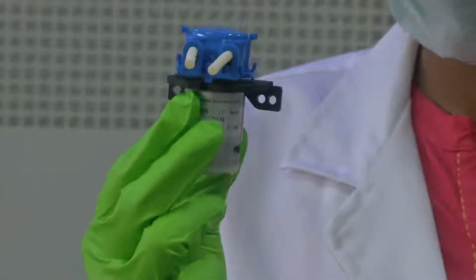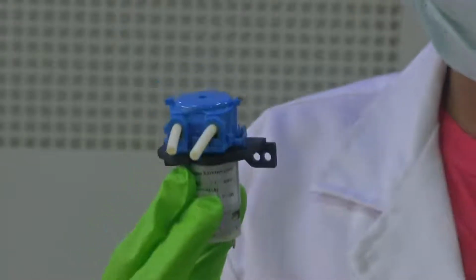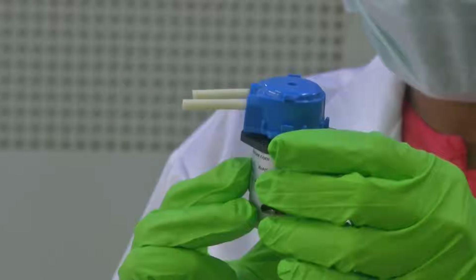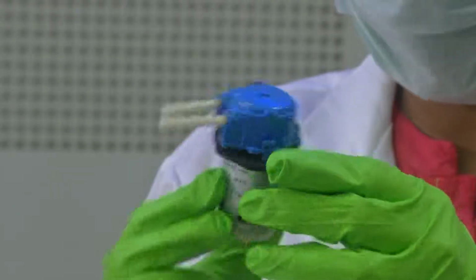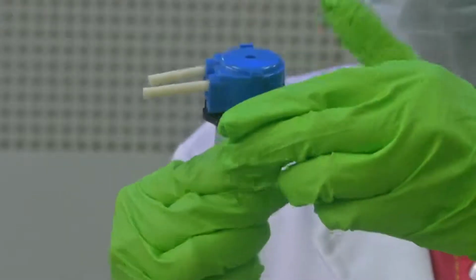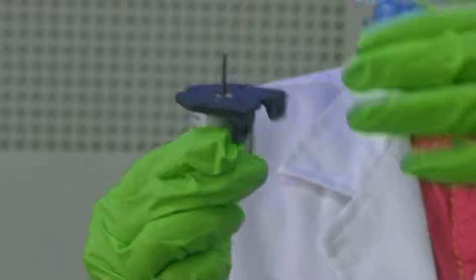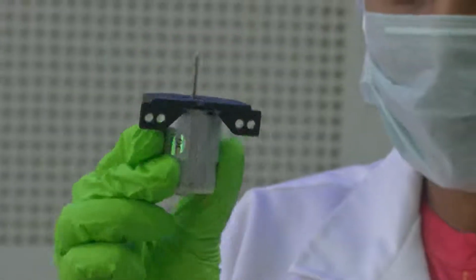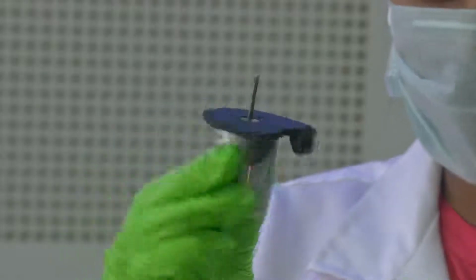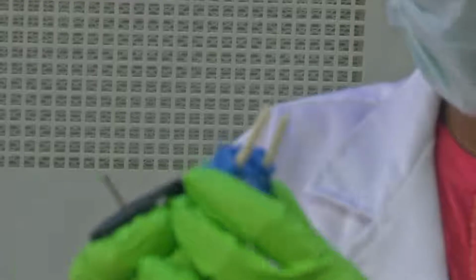Like I spoke about the peristaltic pump, this one in my hand is one such pump. This could flow around 90 ml of fluid. Let me show you part by part. This forms the motor part of the pump, which is the driving force, and here is the casing.